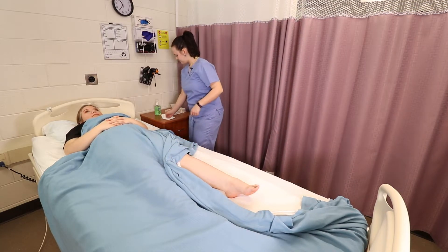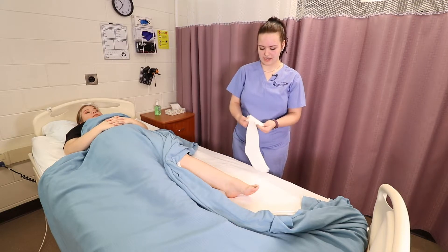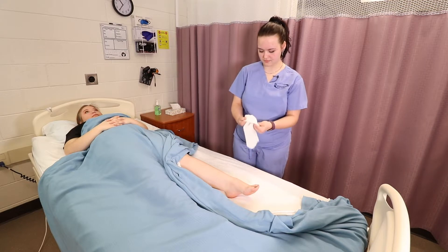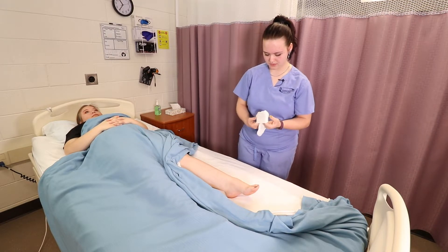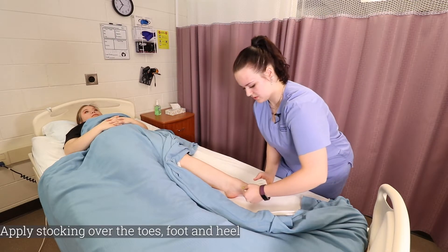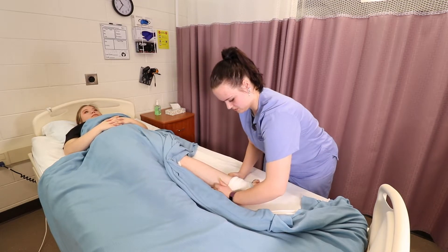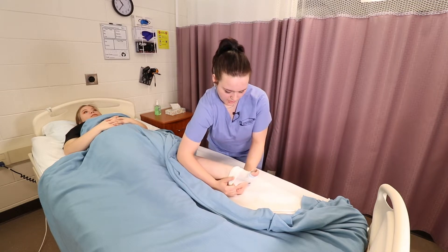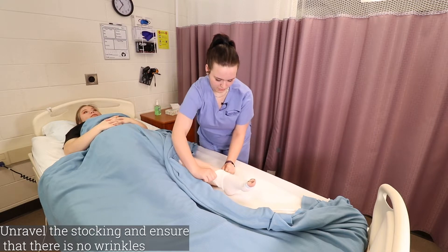I'm going to grab the stocking and fold over the top down to the heel. I'm now going to apply it over the toe, the foot, and the heel. And then from here I'm going to unfold it and pull it up her leg.